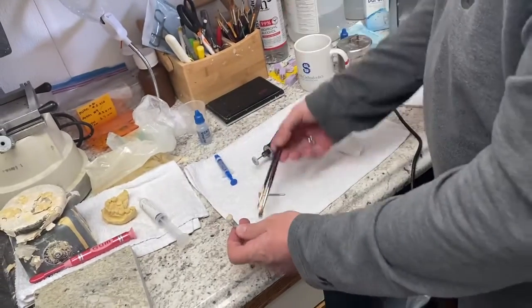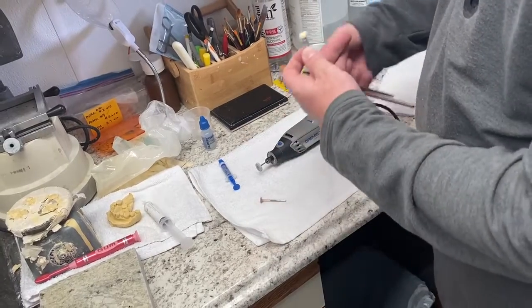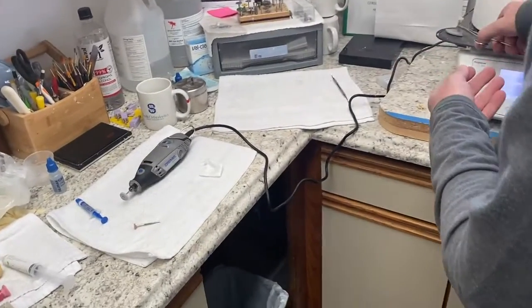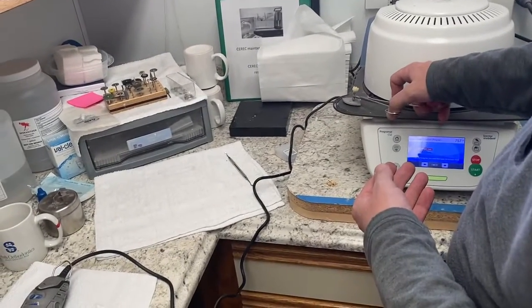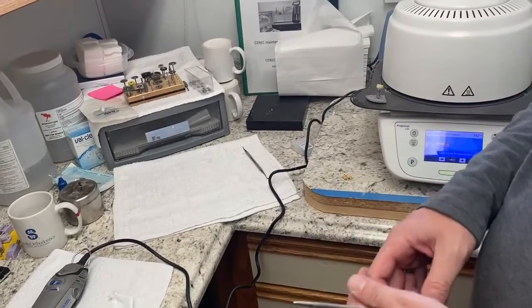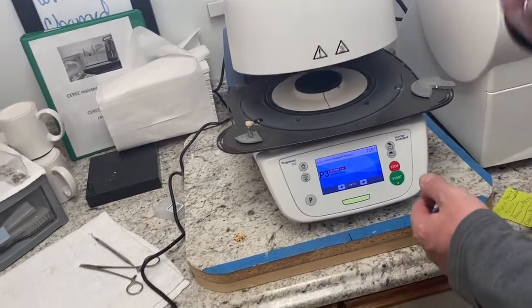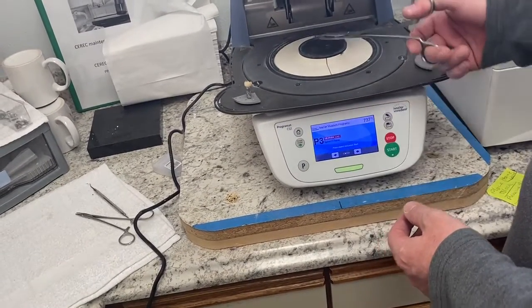Always clean your brushes right away in the alcohol and dry. Then you're going to place your peg on one of these trays. All you have to do is place it right down in the hole. You're going to open your oven, and using your long tongs, because you have to get it right into the middle.